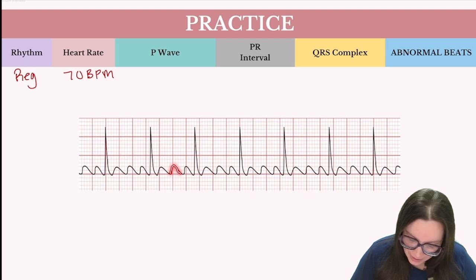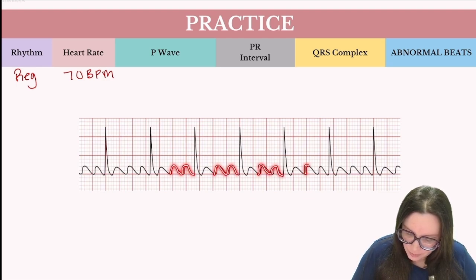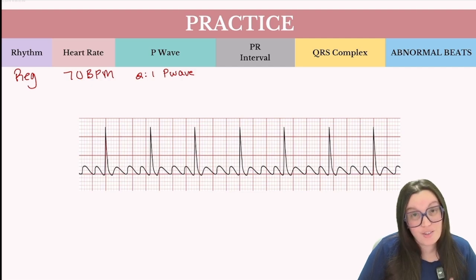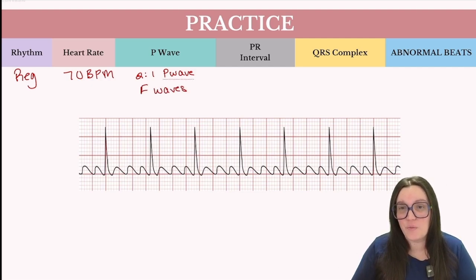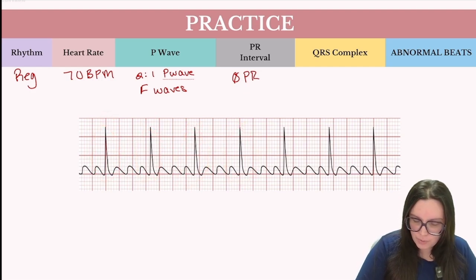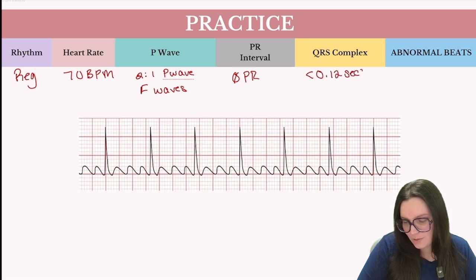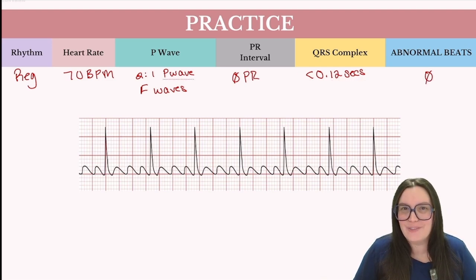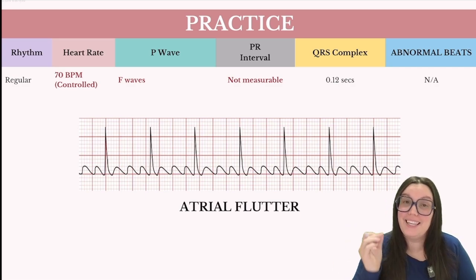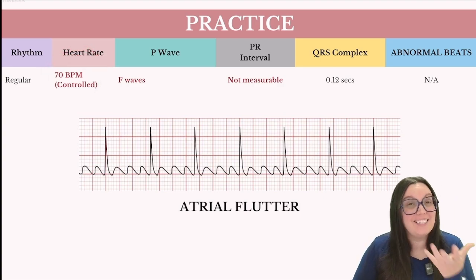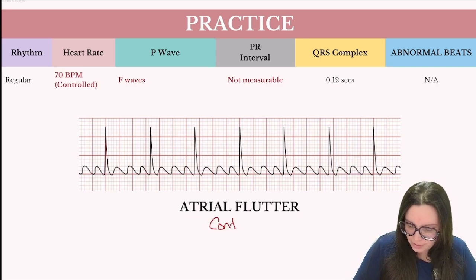Next, taking a look at our P waves — we actually have extra P waves compared to our previous rhythm. In this case, we're going to have a 2-to-1 P wave pattern, and these are also known as F waves. Because of the presence of F waves, we're not going to have a measurable PR interval. Our QRS complexes look very narrow and normal — less than 0.12 seconds — and there are no abnormal beats. The correct rhythm is atrial flutter. Being that we have a heart rate of 70 beats per minute, which is less than 100, we can call this controlled atrial flutter.